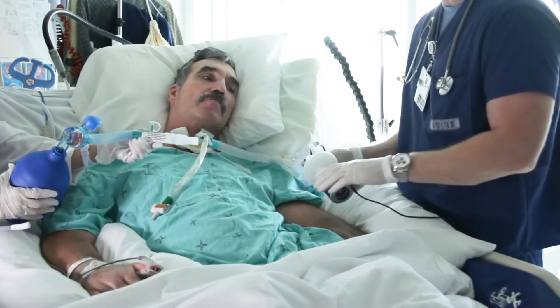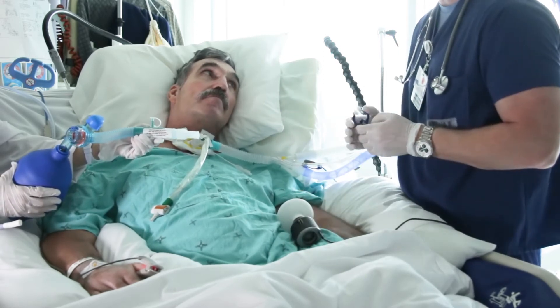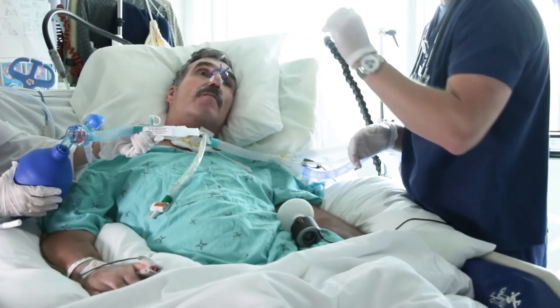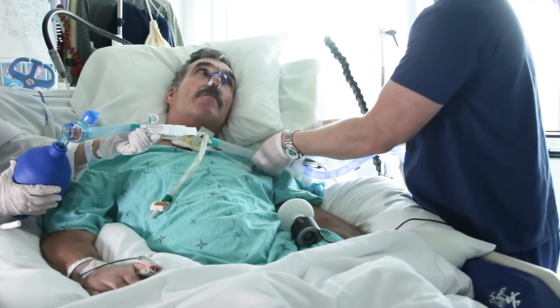So when we're ready, I'm going to disconnect you from the ventilator, and Carol's going to put the mouthpiece into your mouth and give you your breath. I'll apply the nose clips right now — you're good to go. I'm going to disconnect you from the ventilator.